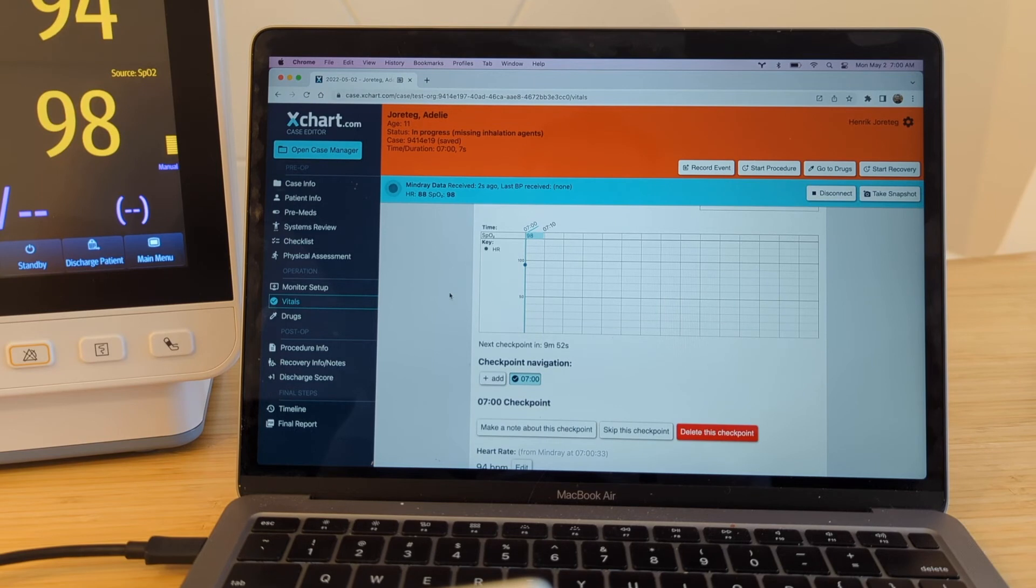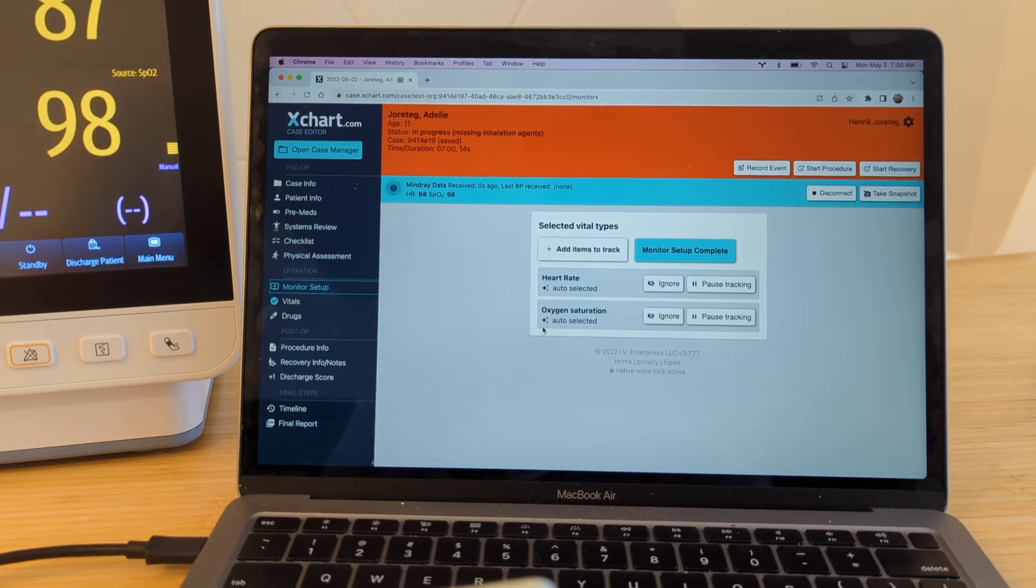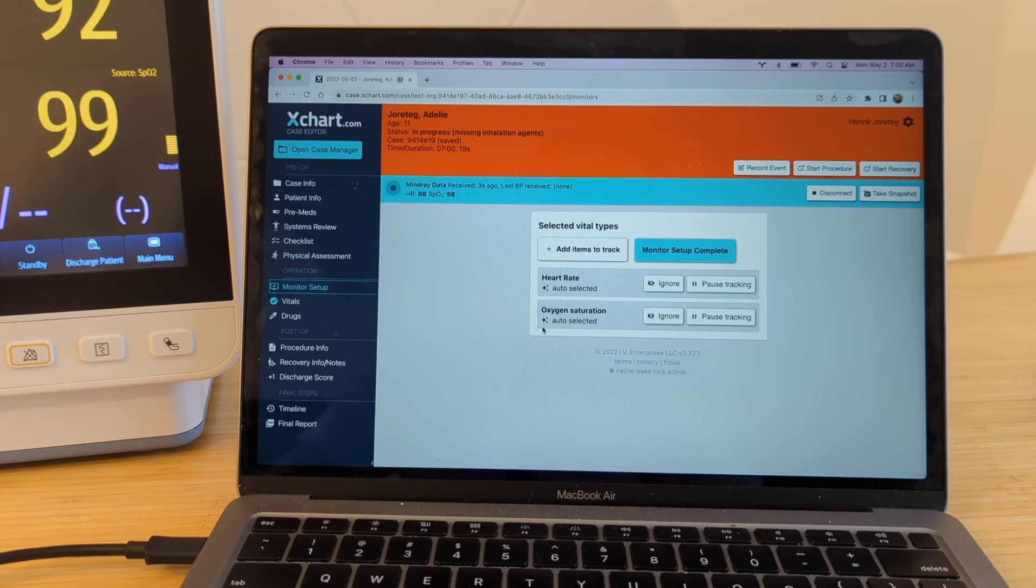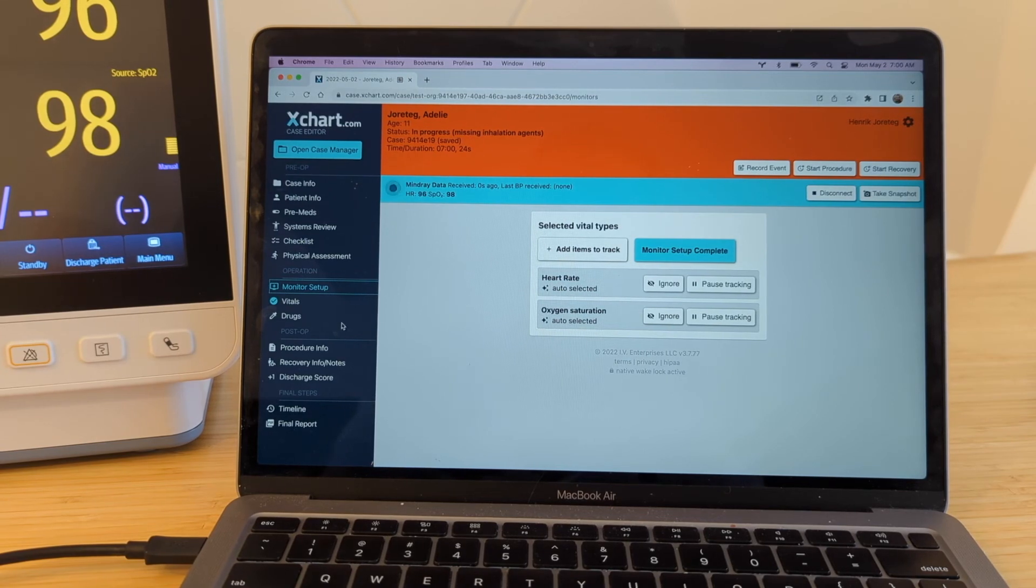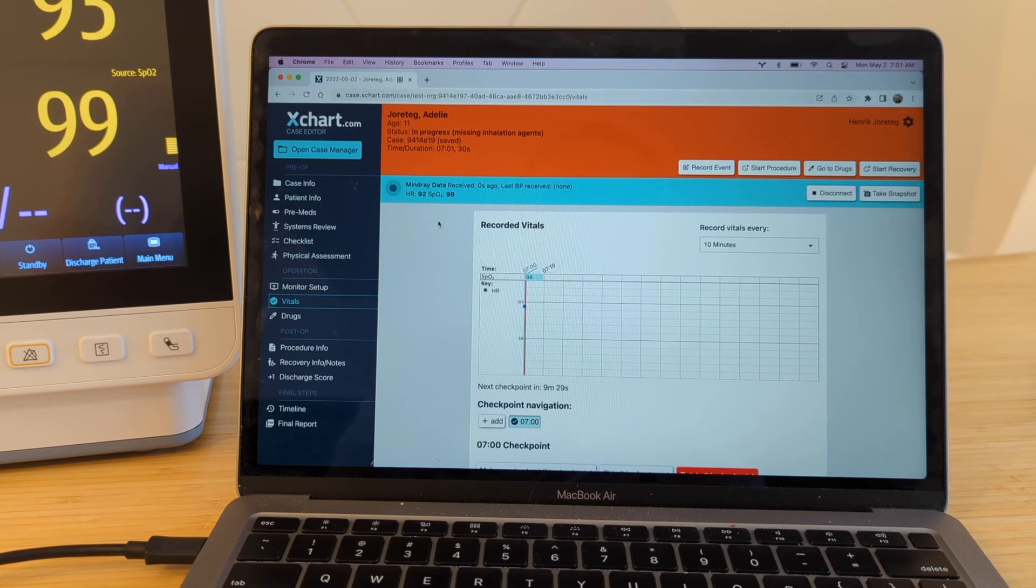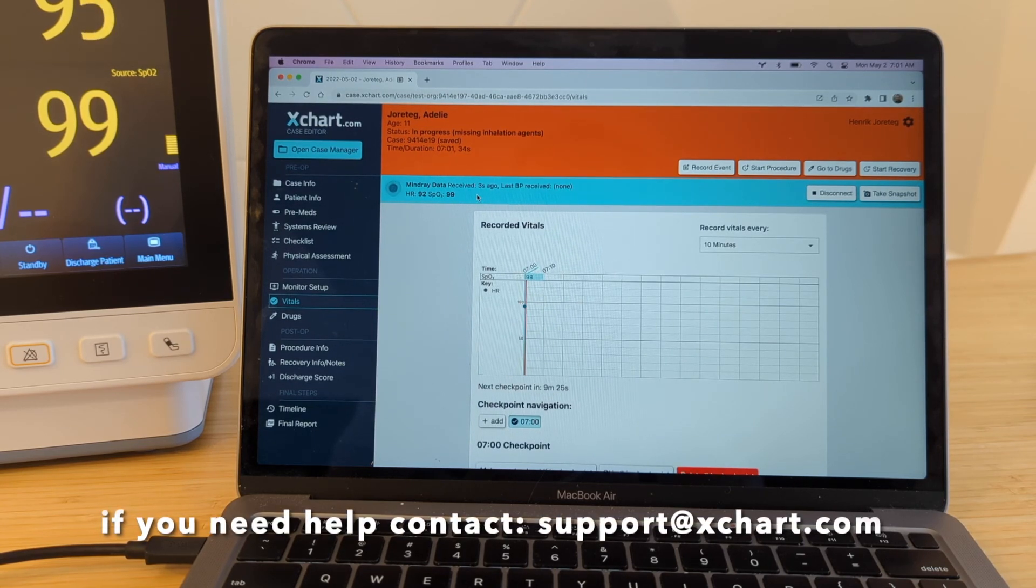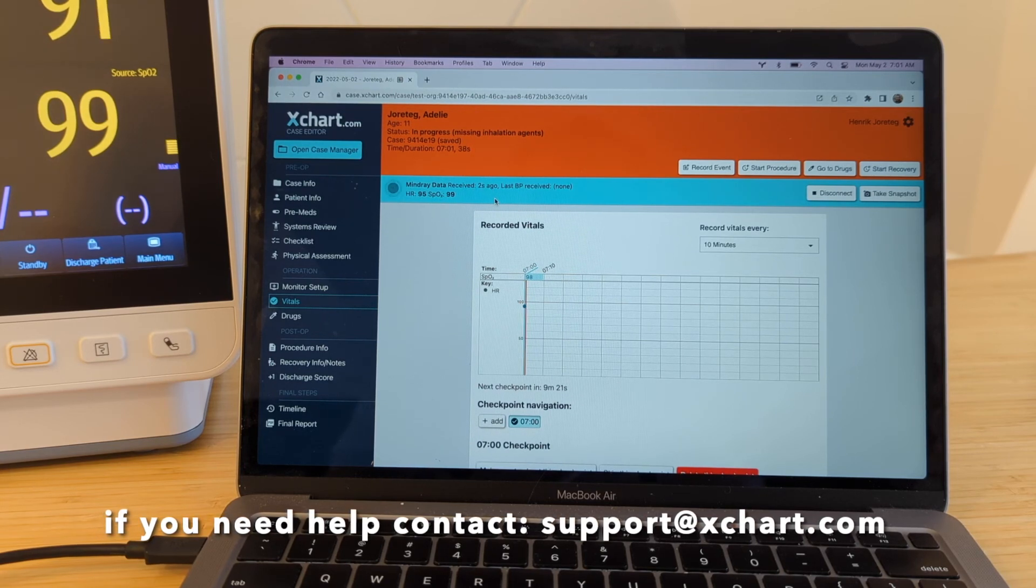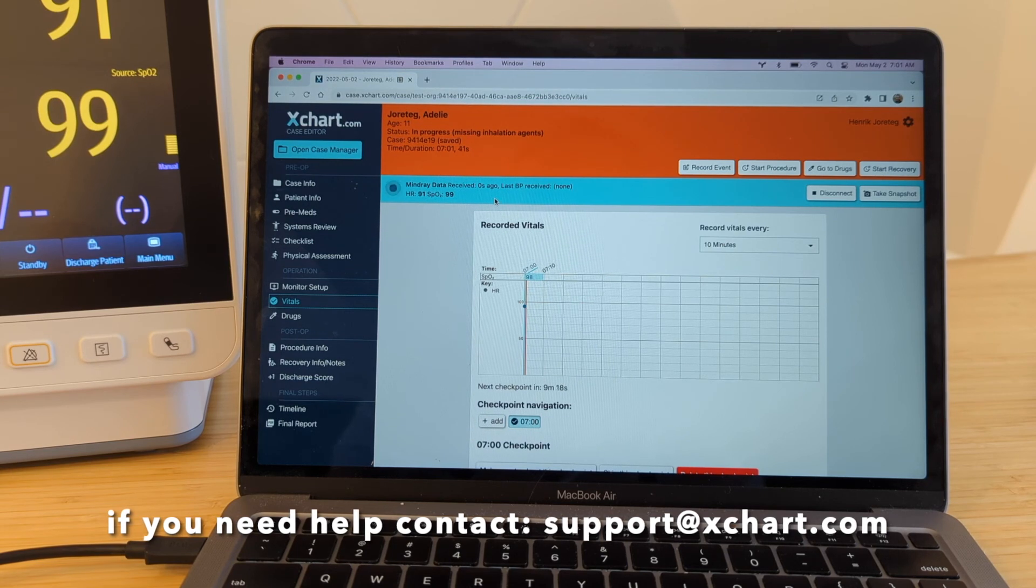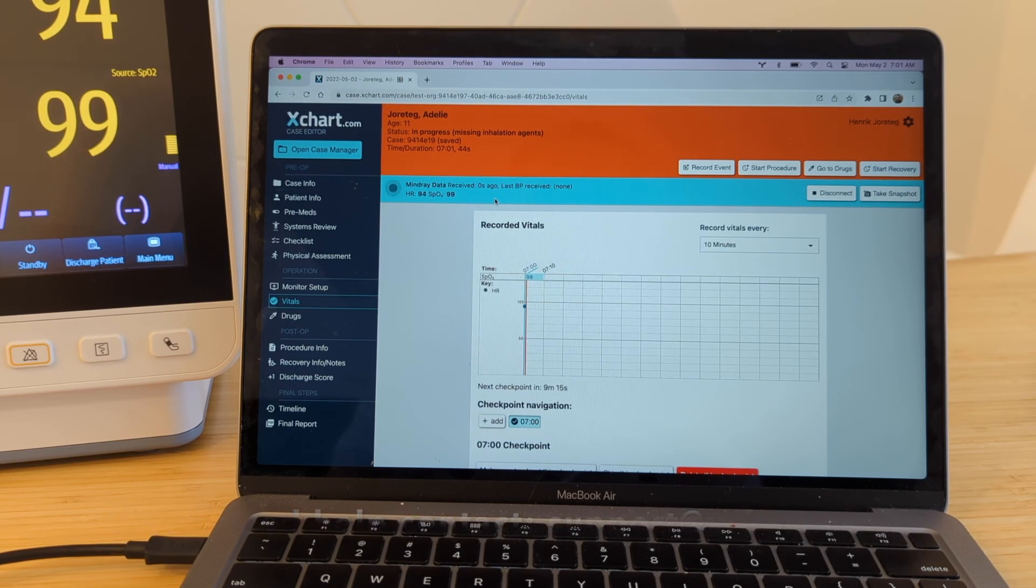And if you go to monitor setup, you'll see that it selected heart rate and oxygen saturation, which are the two things we can get out of this thing. So at this point, just start keeping hooking up monitors to the patient. And you can just keep an eye over here on the vitals page. Make sure everything looks good. Make sure you're getting the values you're expecting. But basically, the way it works is if it gets values that seem like real values, it will automatically select that type of item to monitor and then start keeping track of it for you on your vitals page.